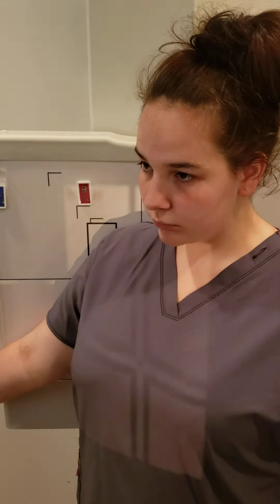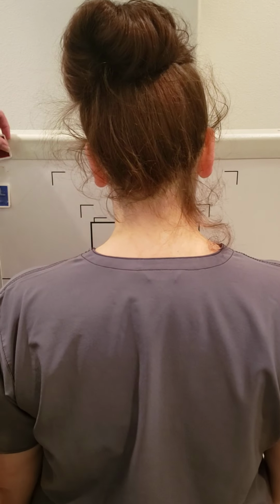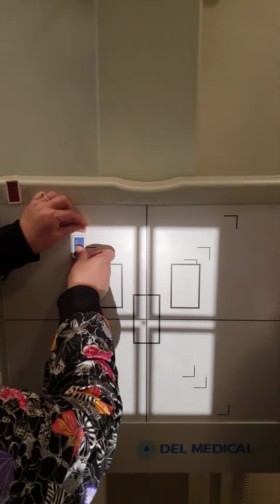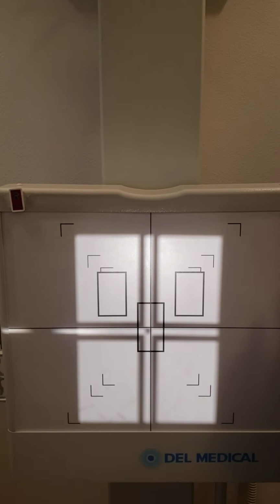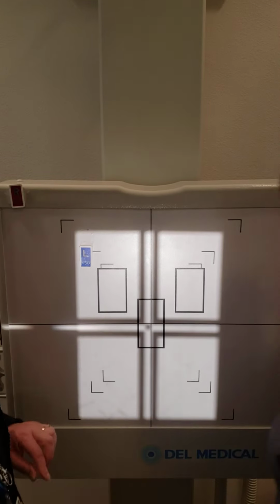And let's go ahead and turn you to face the board. I'm going to go ahead and this time show you her left ribs. So go ahead and step to your right. We'll use the same collimation. This time we'll get you to go ahead and stand so you're facing the board.